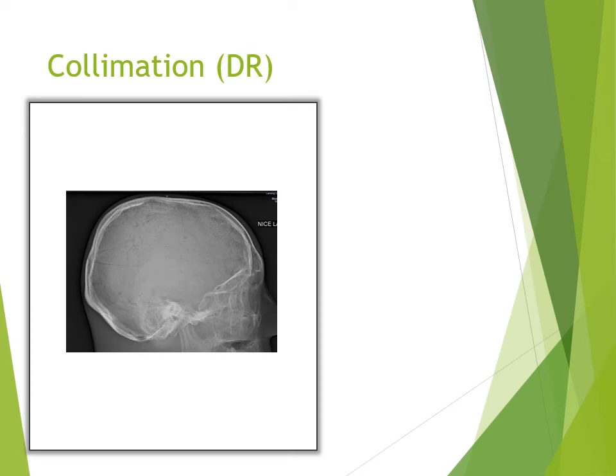An example of how a computer might find an image on a DR imaging plate can be by pixel analysis, and can use the histogram to find the image pixels. Here is a lateral skull image that is properly positioned and tightly collimated, captured on a 14 by 17" imaging plate.